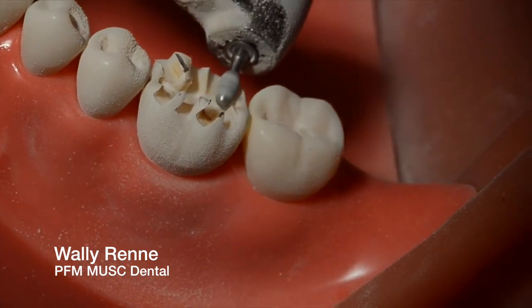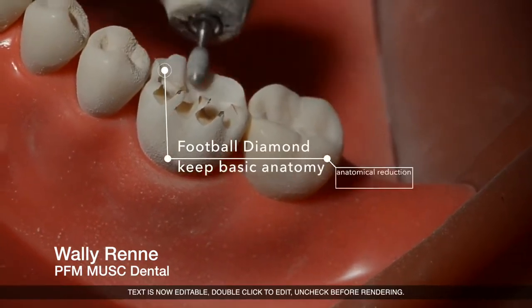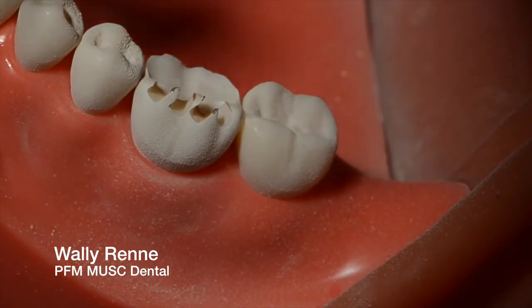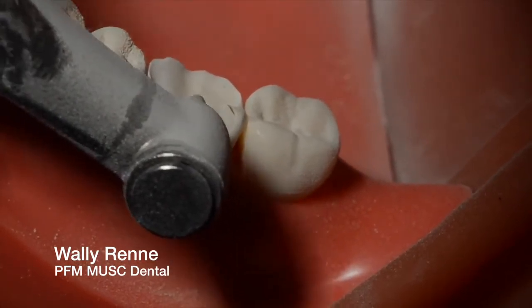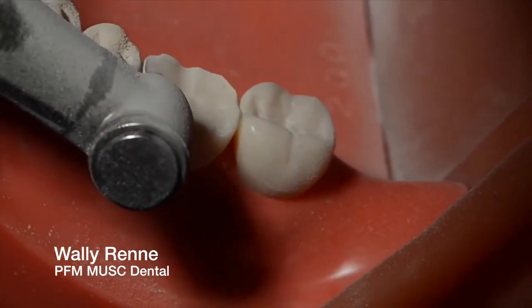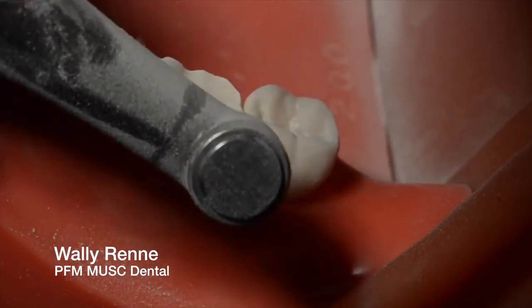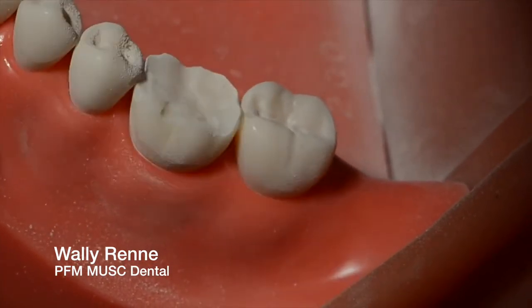Smooth all those out with the football diamond real quick. Don't focus too much on having everything perfect at this point — we'll go back and do that later. I'm not really worrying too much about anatomy. I'm going to do a simple Y shape with the football and re-accentuate that later.